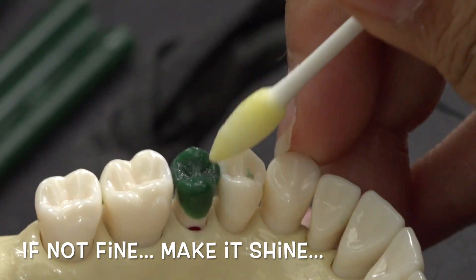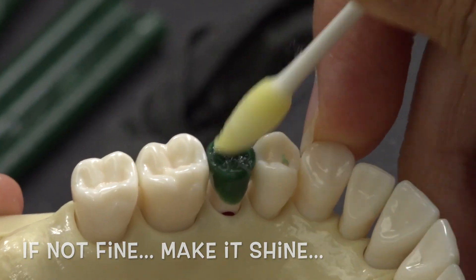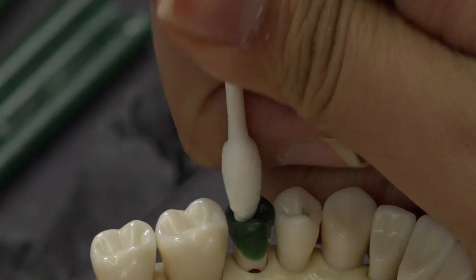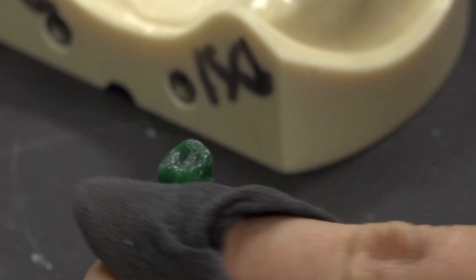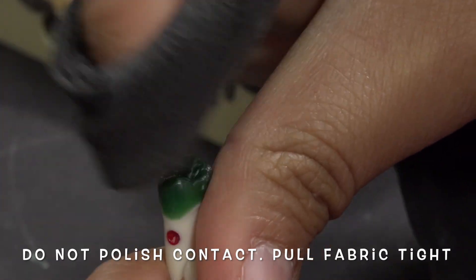To polish the occlusal, use a Q-tip soaked in soap and water and rub it into the occlusal. Then use a clean, dry Q-tip and wipe away the excess soap and water. Lightly polish with the stocking, making sure not to polish away the points of contact. You can avoid this by only polishing under the contact. Make sure to angle the stocking when polishing to not lose any of the angles you created.